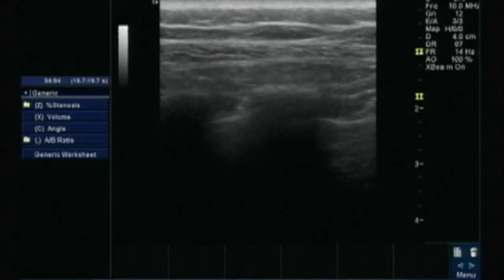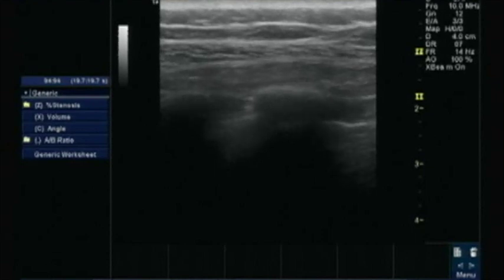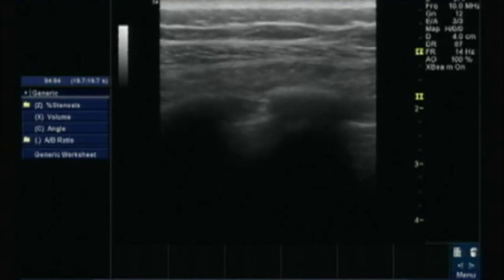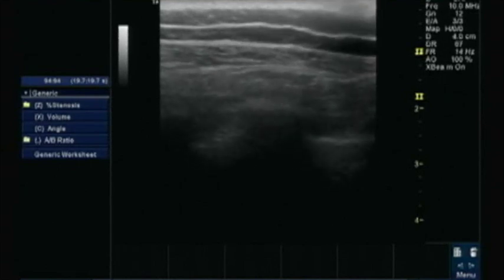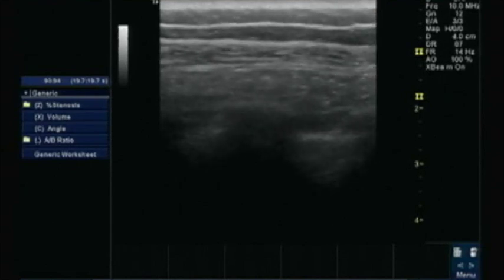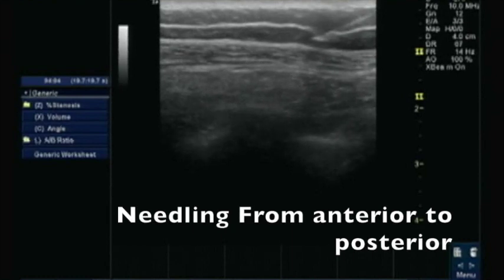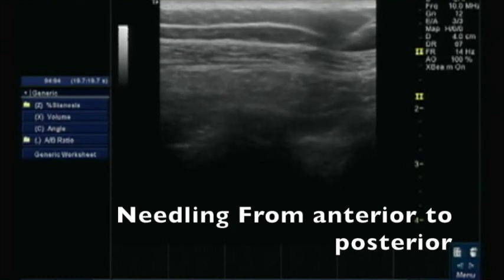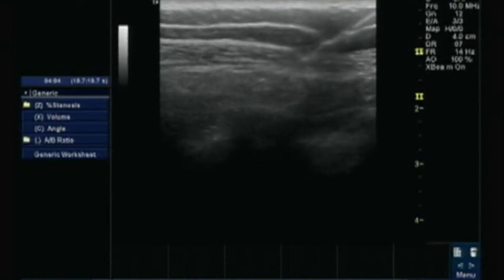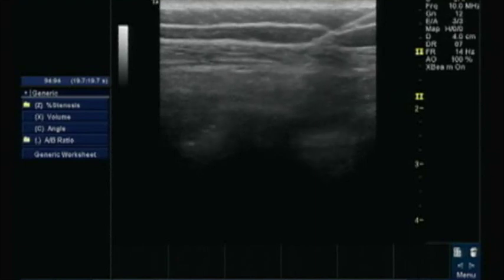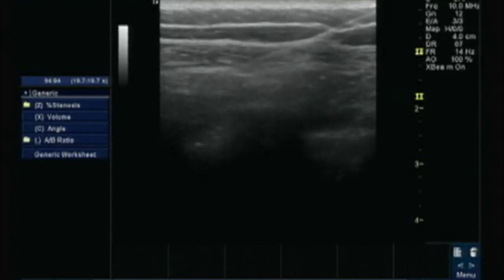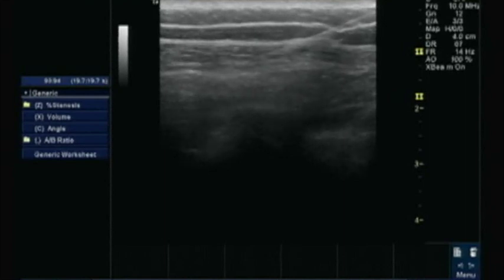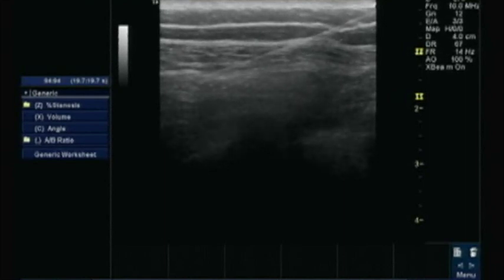Basically you are targeting the lateral branches of the intercostal nerves. Again, your needle will travel in an oblique plane — you will go anteromedial to posterolateral. You will pass your needle through the latissimus dorsi and inject the drug between the latissimus dorsi and serratus anterior.